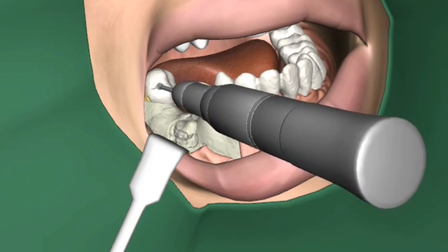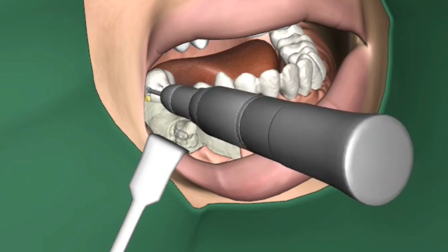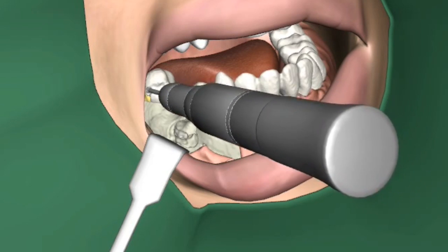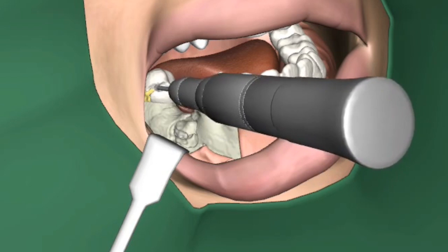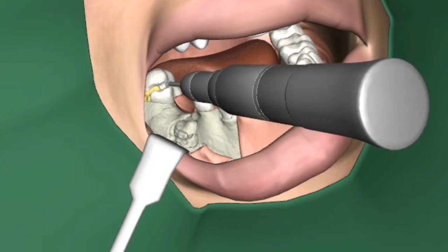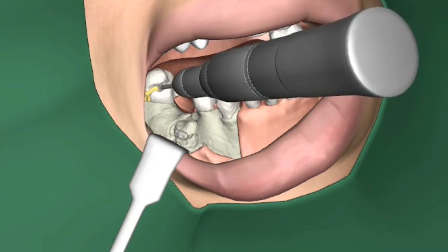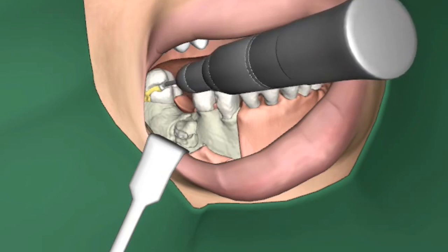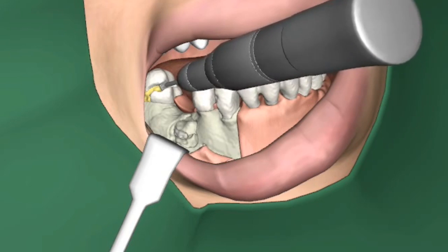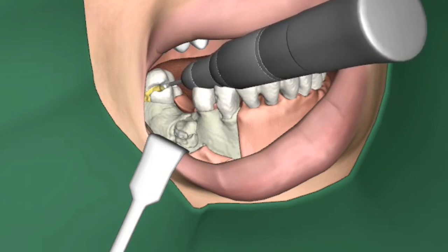Next I extract the second tooth. Here I also have to section the tooth and take it out in parts. As you may have seen, the fidelity of the simulated elevator is not as precise as that of the drill. But the role it plays here is to show the student all the steps involved in the procedure and that you have to drill enough in the right area in order to proceed.